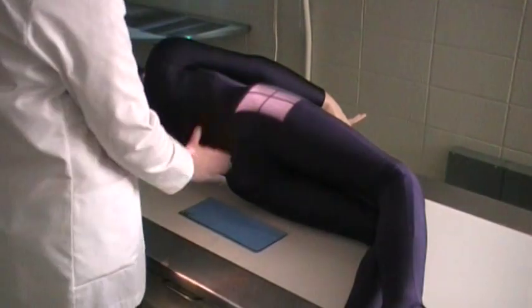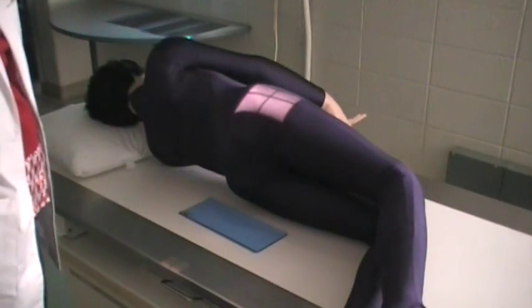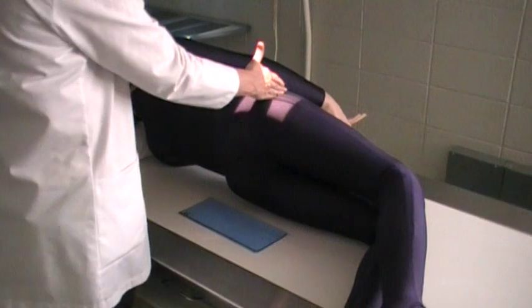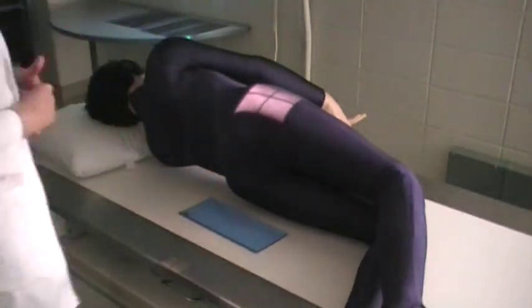Some technologists like to palpate for the landmark of the coccyx itself. Another way of locating the coccyx is the greater trochanter — the prominence of it will be at the same level as the coccyx.